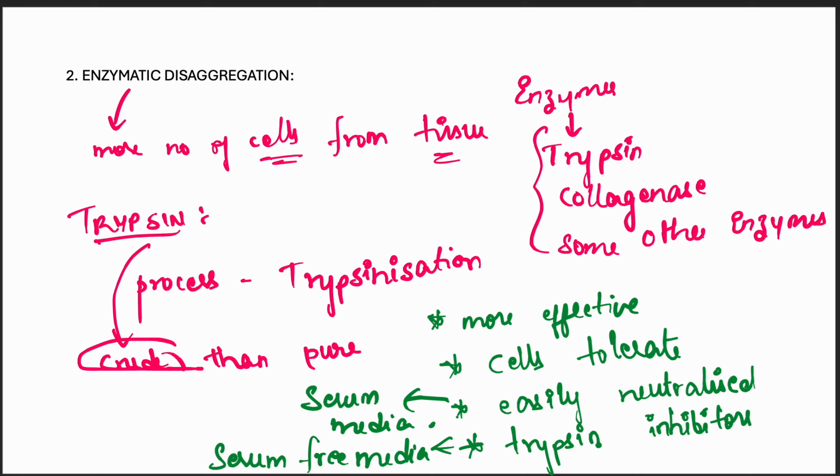So for that reason we select crude trypsin over pure trypsin, and it is also less toxic, and it is specific in its action.